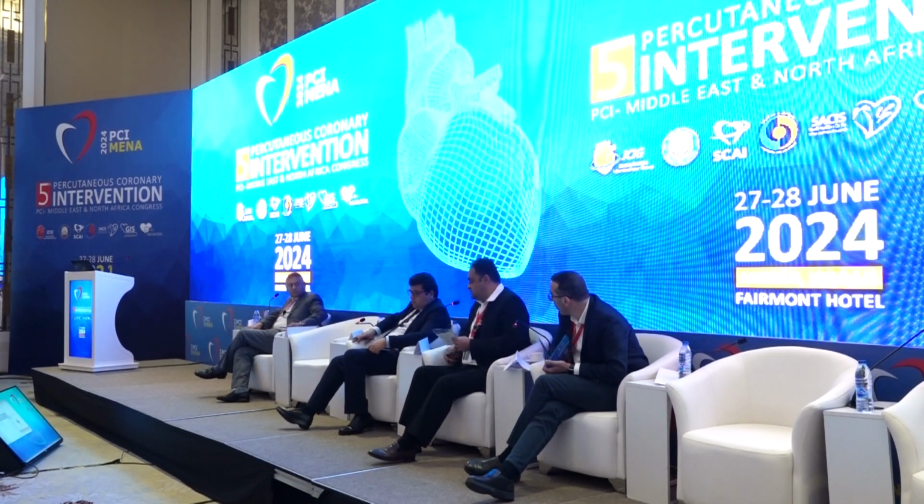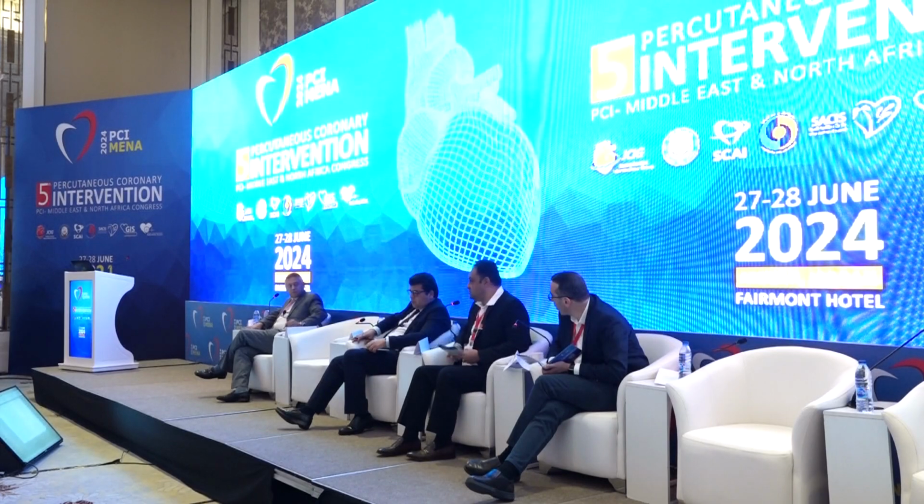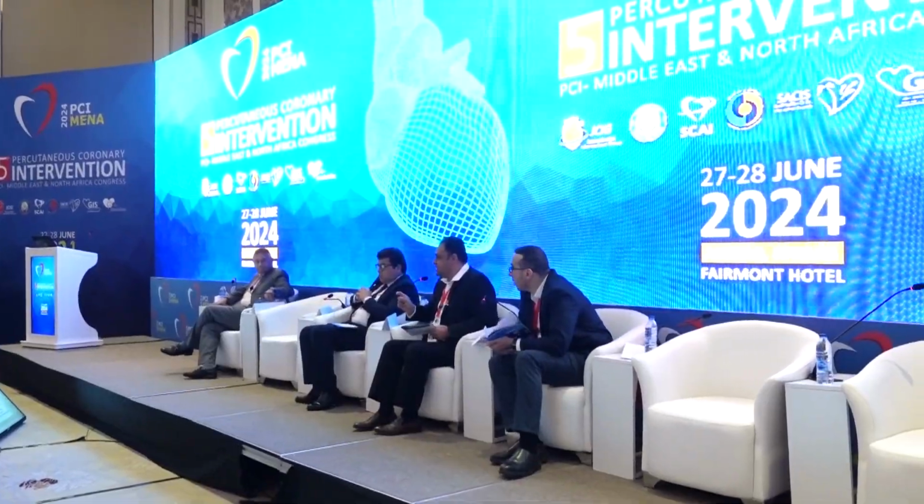Yeah, thank you for the speakers. Two mixed comments and questions. The first one for Dr. Fadi: we noticed that the main obstacle was the cost, then the cost, then the cost in choosing the modality of preparing the lesion. Now, is this approach to start, of course, the cheaper will be the balloon, so start with the balloon, then upgrade your cost, let's say, but we know that traditionally it's better to avoid ballooning if you are planning to do the rotablation. So, any comment on this point?